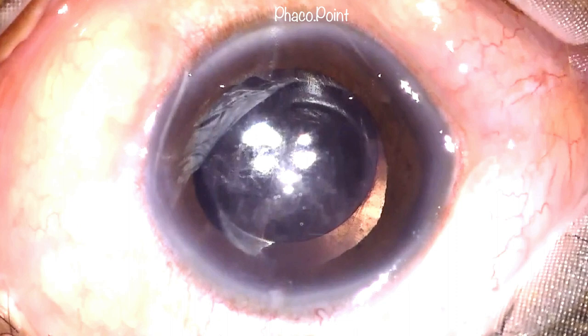She was asymptomatic and had a visual acuity of 6/9. On clinical examination, we saw a stable IOL, a large superior posterior capsular rupture, and a significantly large vitreous blob in the anterior chamber. A decision was taken to perform an anterior vitrectomy, look for the stability of the IOL, and then take further decisions on table.